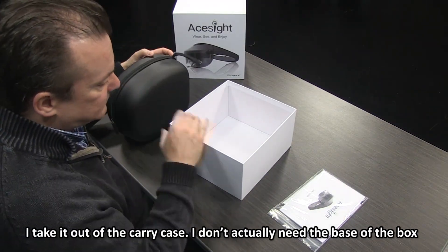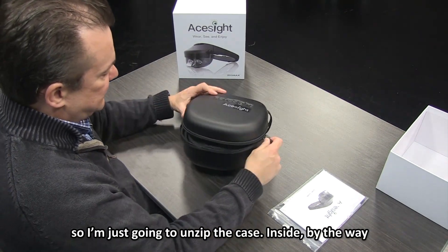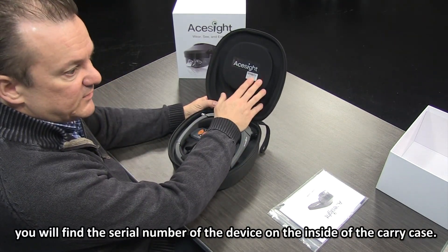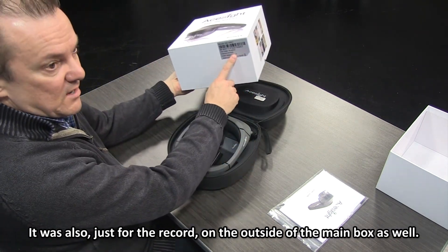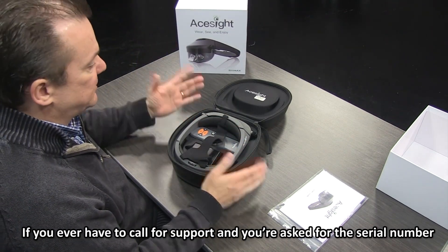Take out our carry case. I'm going to unzip the case. Inside you will find the serial number of the device on the inside of the carry case. It was also on the outside of the main box as well. So if you ever have to call for support and you're asked for the serial number, that's where you'll find it.